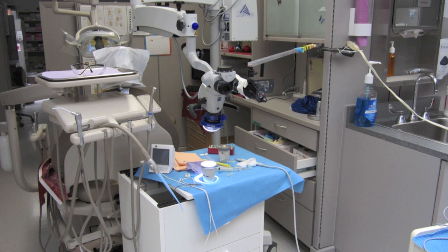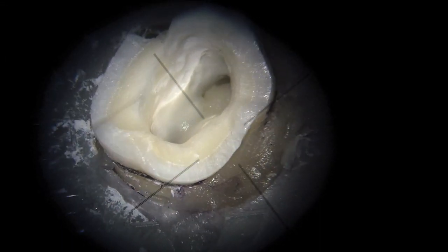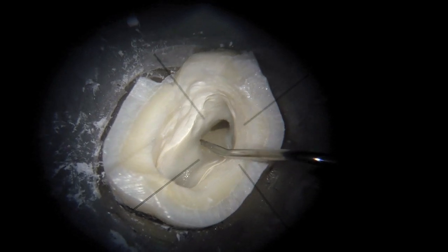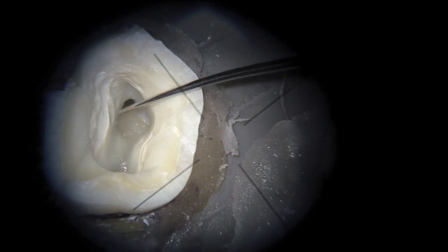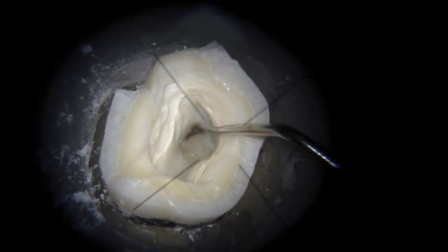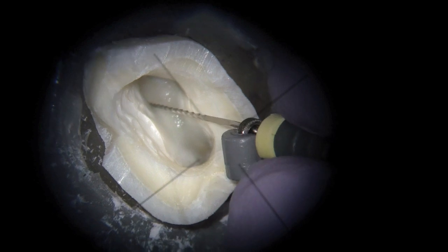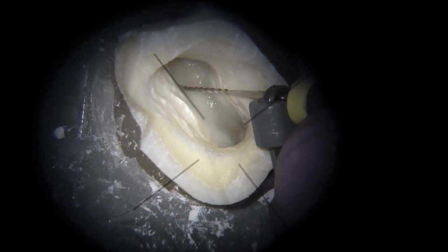Here's another shot of the setup — you can see the Rude ZX and a few other instruments I was using. I want to continue down the path of opening up and troughing this region between MB1 and MB2. The best way to discover MB2 is to draw a line from MB1 to palatal and intersect that with a line from the distobuccal — that gives you an approximate region. Here you can see the Rude ZX clip on there; I'm just confirming patency of the MB2 canal.